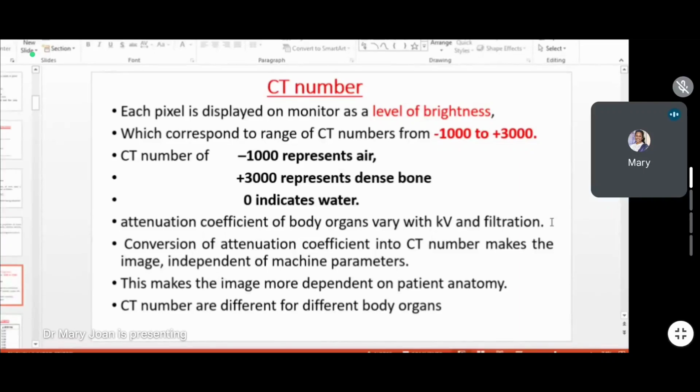Different tissues attenuate differently. Different organs, which are composed of different types of tissues, form an image because of their density differences, and they can be resolved from each other, meaning you can identify one tissue as one and another as another. But the problem with increasing the energy is that for higher energy X-rays, all of the soft tissues will look the same. We will not be able to make much of a difference between closely similar soft tissues.